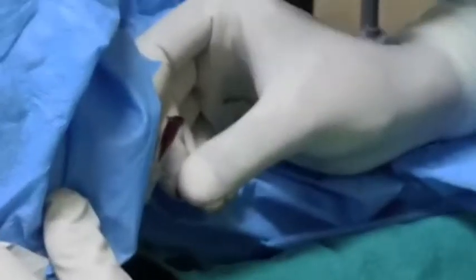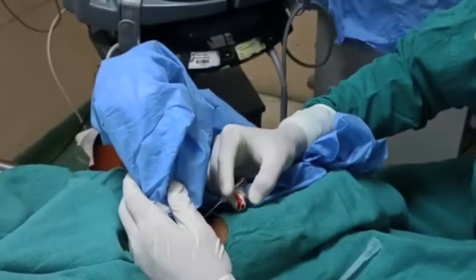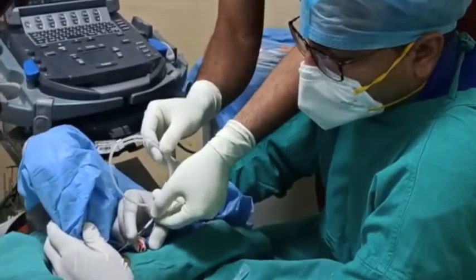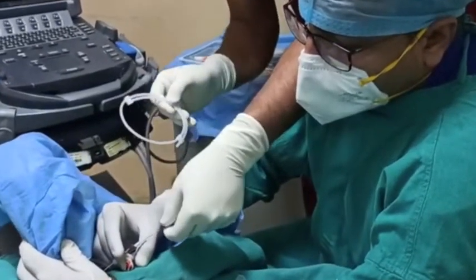You can identify the vein and puncture it. You can see the free flow of blood coming out. Then we put the guide wire into the introducer needle.